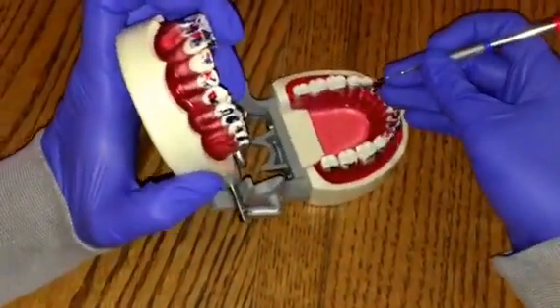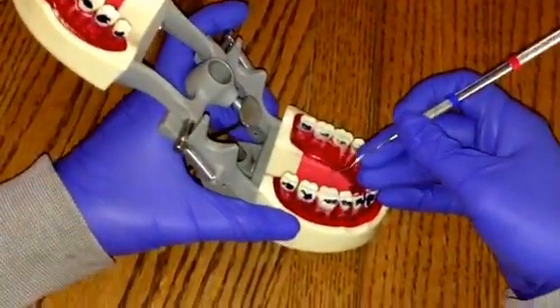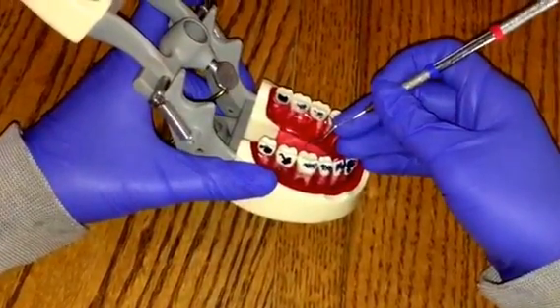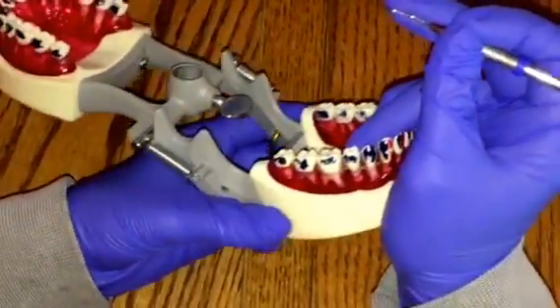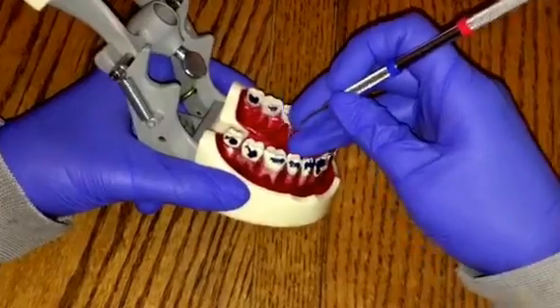Okay, Gracie, thank you very much for showing me. There are a few areas that I want to review with you. Let's go back to number 30. When you are using sweeping strokes and going into the distal, make sure that you go all the way into the col and do not stop short. If you stop short, there could be a piece of calculus right underneath the col and you would miss it.